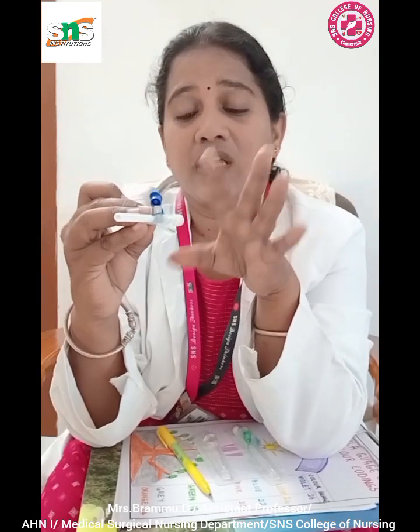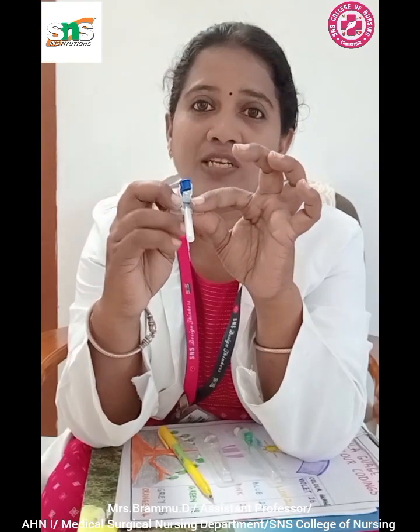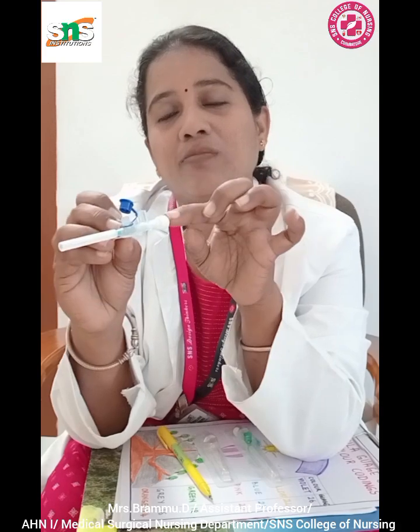So this is enhancing the flexibility of patient care. We are not going to disturb the patient if the patient is in a deep sleep. In case the patient is on IV fluids and needs an antibiotic, you can use the adapter, close the chamber of the IV set, and then continue the medication dripping into the IV line using this injection port. This gives better flexibility in patient care without disturbing the primary IV line.